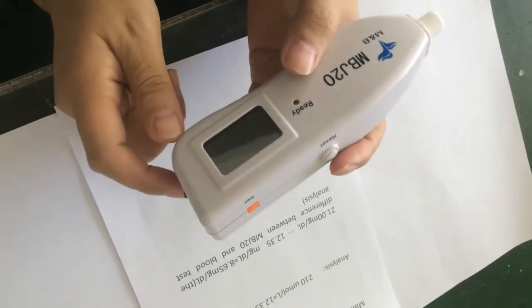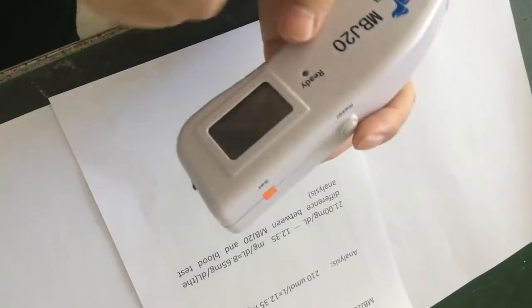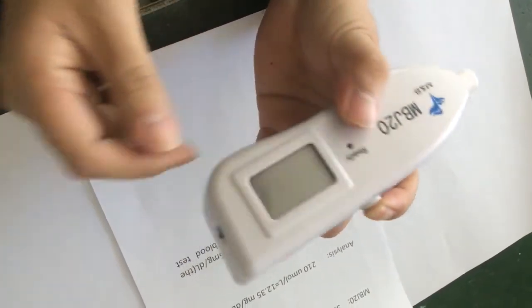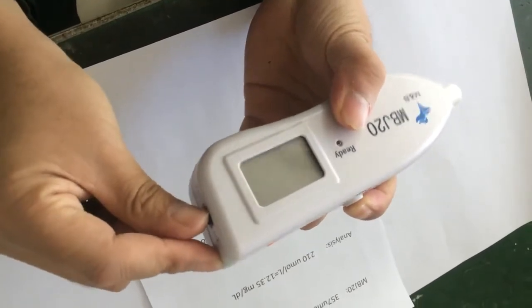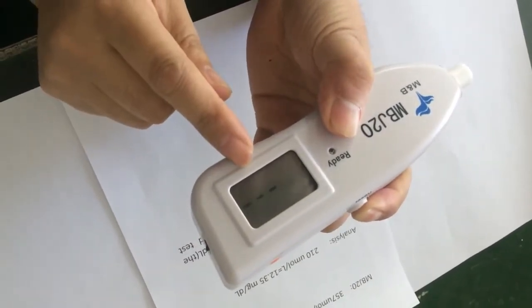Let's enter the calibrating interface. First, press this button — the reset button. At the same time, switch on here, and wait until the number appears.